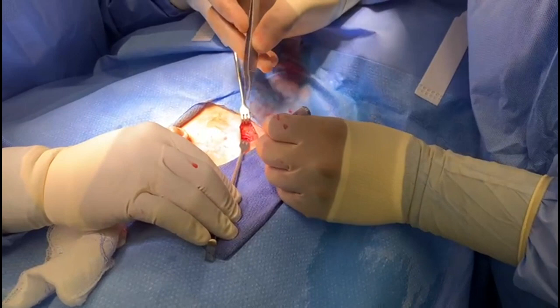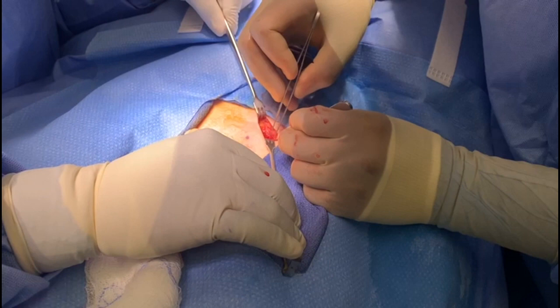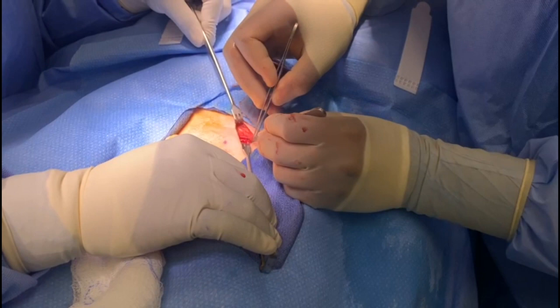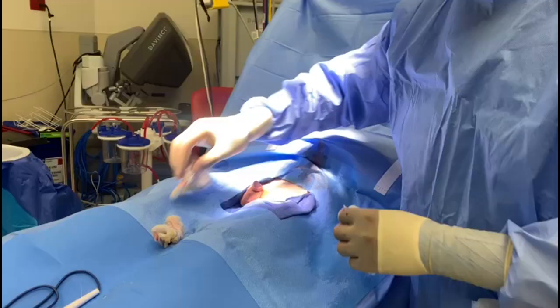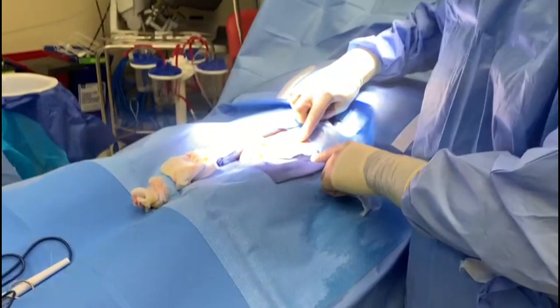Now we're going to close the inguinal incision. We have the external oblique that we opened, so we'll be closing that. We preserved the inguinal nerve, which sits right here — we're going to leave that intact, separating it from the undershelving so we don't entrap it and cause future inguinal or testicular pain. Hernia, hydrocele, and orchiopexy complete. Here's our incision — we'll apply Dermabond and we're all set.